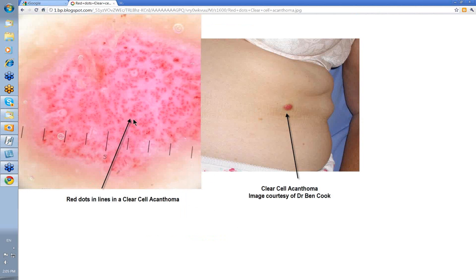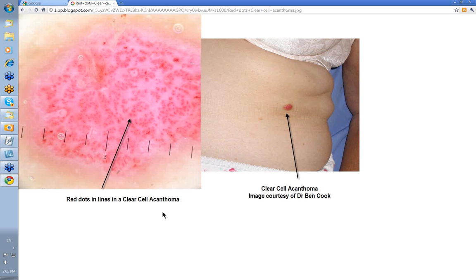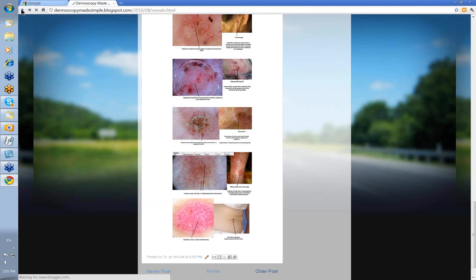This is a clear cell acanthoma. Here you've got vessels as dots but dots arranged in serpiginous lines. That's the picture you'll see in a clear cell acanthoma. A good one to remember: dots arranged in a serpiginous pattern is a clear cell acanthoma.